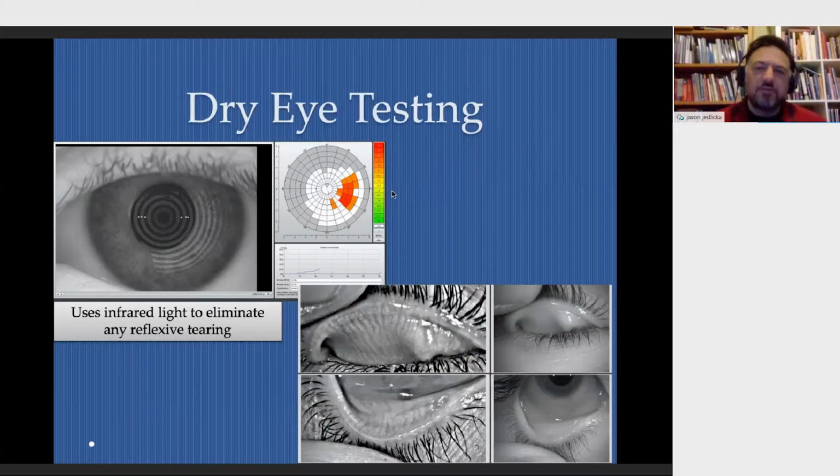Also, again, the dry eye testing. Many of our contact lens wearers have some degree of dry eye complaints or symptoms. You have the dry eye testing opportunity with the keratograph to have the non-invasive tear breakup time and meibography and redness and tear meniscus and a whole host of measurements to help you to quantify dry eye and help to decide how to better manage patients with borderline or with symptomatic dry eyes.